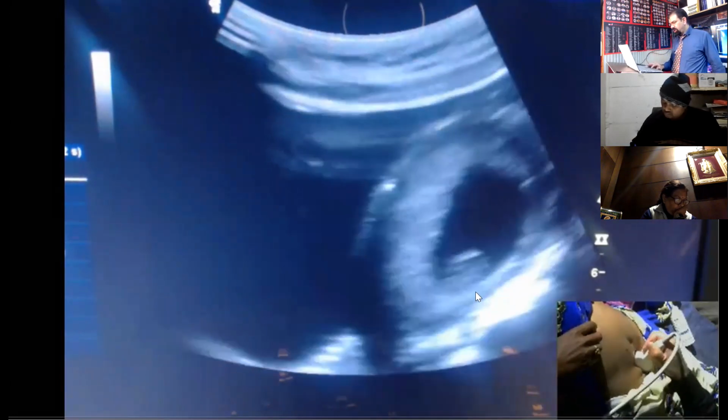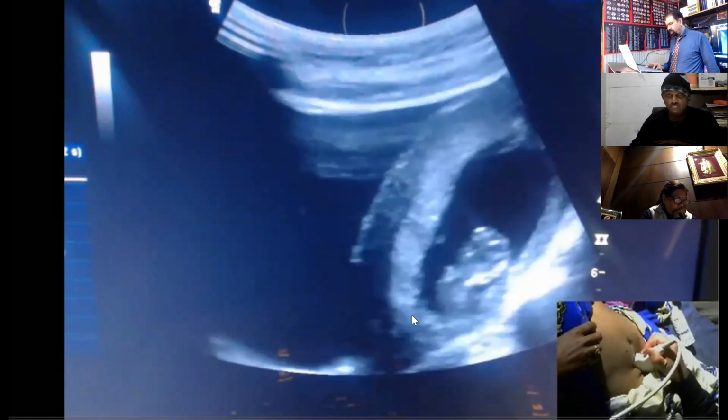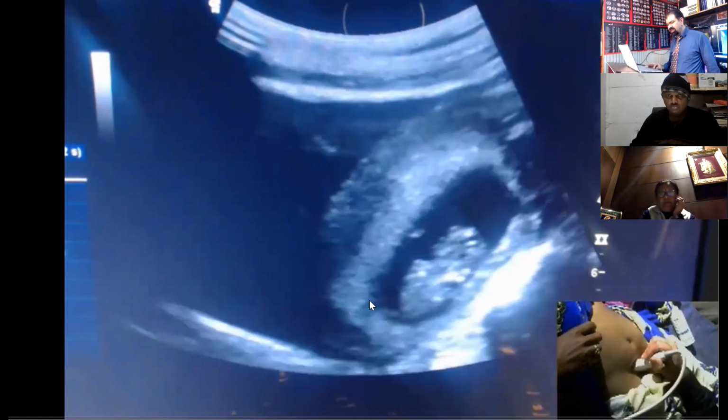So now again showing you how to take this CRL from this point to this point, how to take the gestational sac.